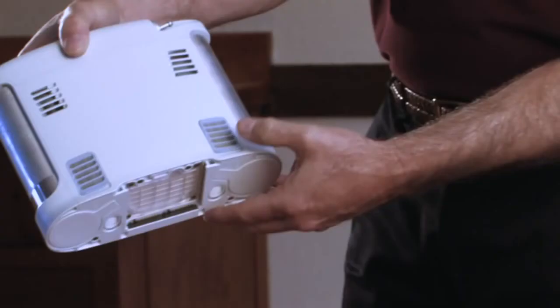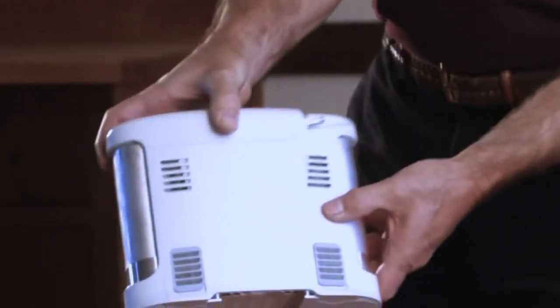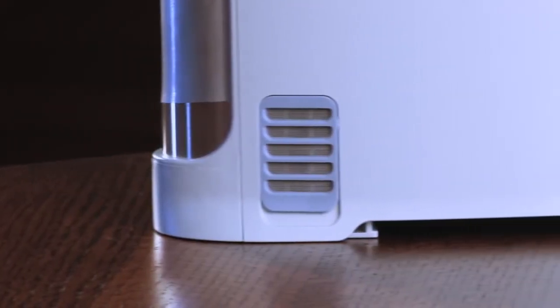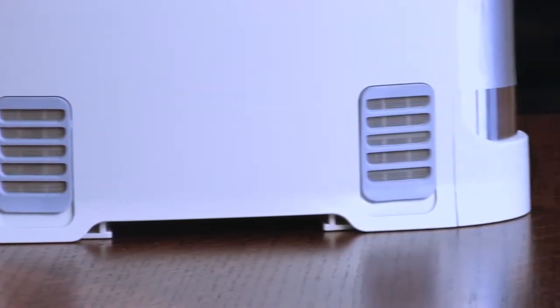Now ensure that both particle filters are in place. Do not operate the Inogen One G3 without both particle filters in place. It is important that you clean both particle filters weekly to ensure the ease of airflow.